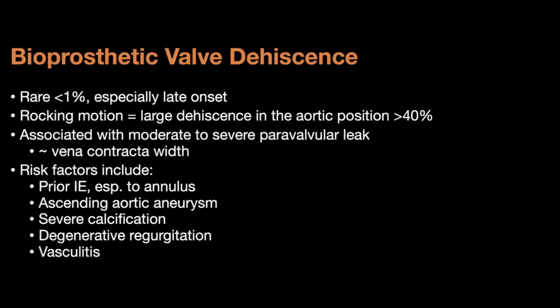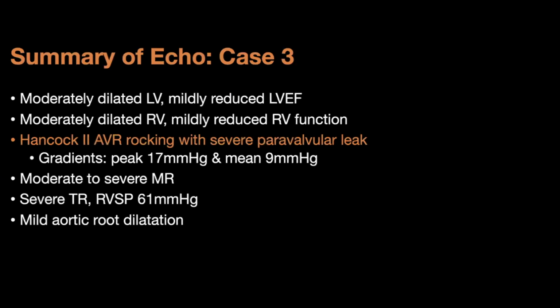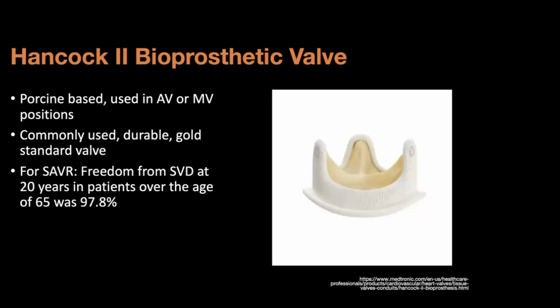Now, was there any paravalvular leak at all in previous studies? There was mild. It's kind of unusual, very unusual, without infection. So at least that was known. And his cultures at the time, did they grow anything? As an inpatient, no.